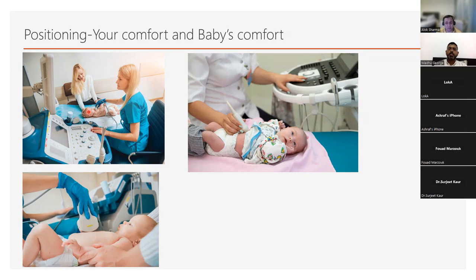It has the thymus. But more importantly, the thymus is something that people get very confused with and make differentials of right upper lobe atelectasis, collapse, consolidation. Now, in a baby who has a tube down the right main bronchus, having a look at the right upper axilla, the right infraclavicular regions is very, very important. So again, you can see how important infant containment is.